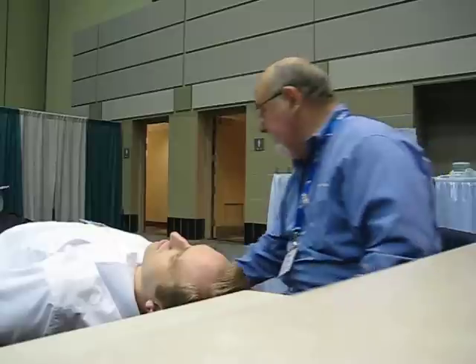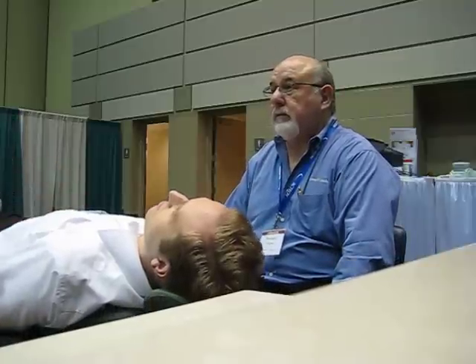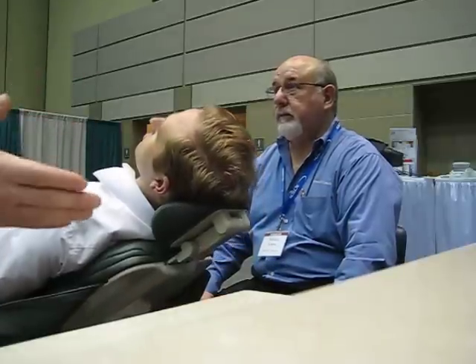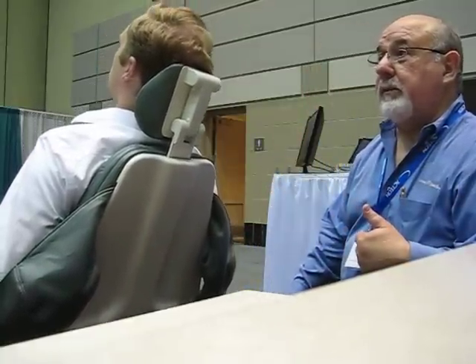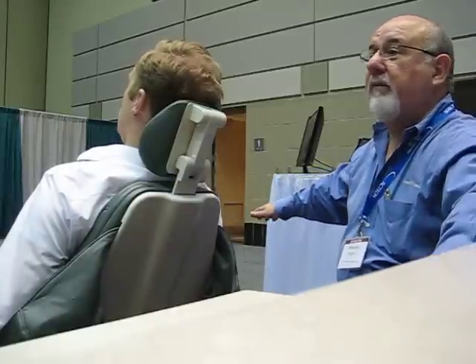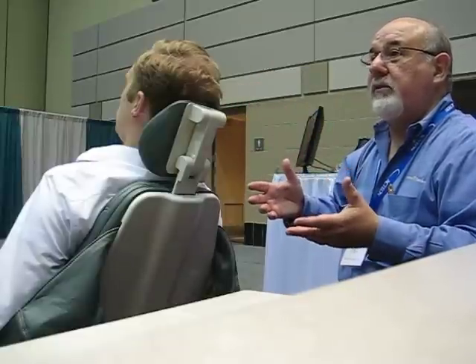All right, so I guess what you're saying is that when you recline the patient in the regular chair, you're right, it's pivoting back and it's changing plane, whereas in this one, as it reclines, it traverses back. Now, if you program it, this chair will also start off forward and traverse back if you want it to, depending upon the procedure you want to do. But the relationship of everybody in the treatment room never changes, because it's the oral cavity we're working on, because it's dentistry, not podiatry, right? Yeah.